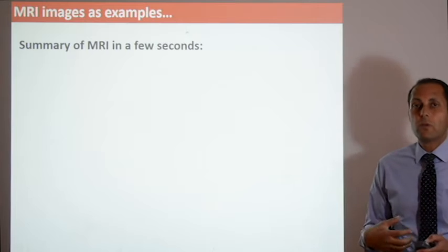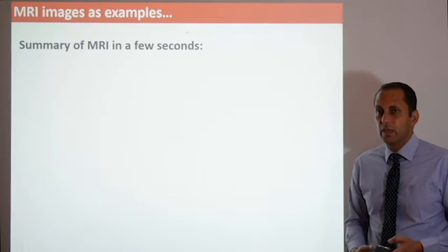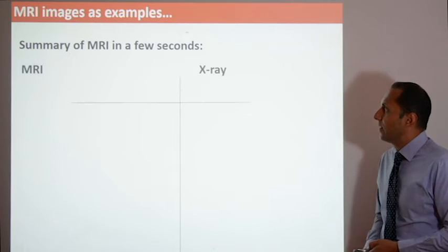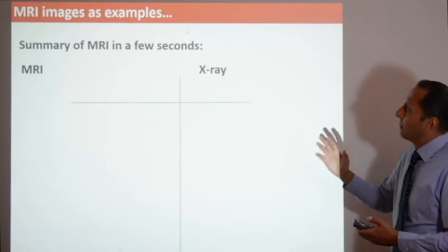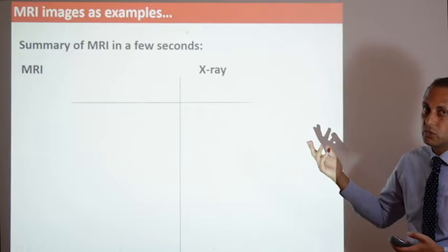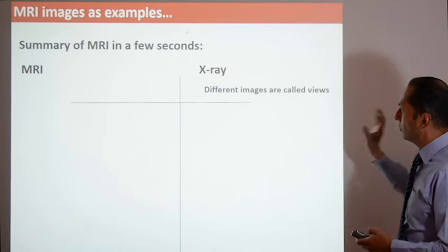Of course, not all of us rheumatologists are so interested in MRI and so experienced in MRI. So I will just summarize MRI in only one slide. This is an oversimplification. I will compare the language of MRI to the language and the terms we use in plain radiography. In X-ray, the different images are called views.